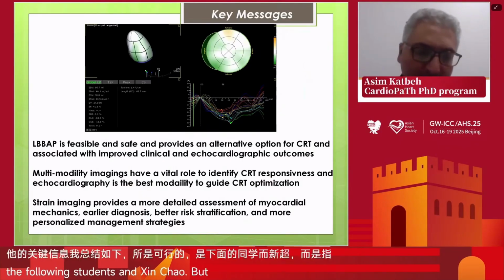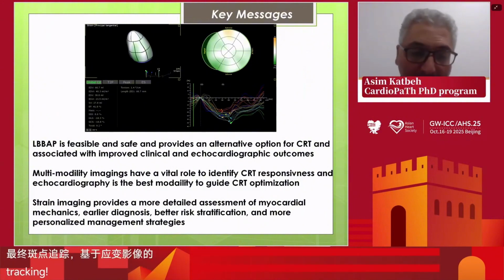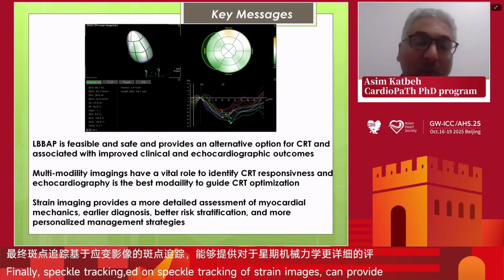Finally, speckle tracking based strain imaging provides a more detailed assessment of myocardial mechanics, earlier diagnosis, better risk stratification, and more personalized management strategies.